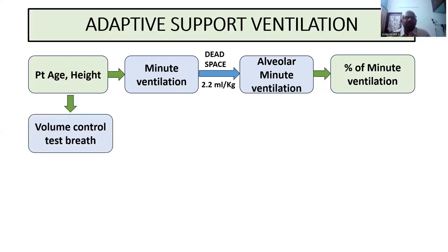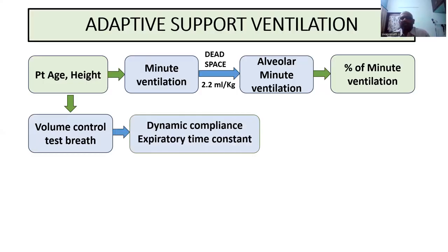Now, once you enter this, it will give a volume control test breath. And once it gives that, it is going to calculate the dynamic compliance and the expiratory time constant. It's a little bit different from all other modes. It will calculate the compliance and the time constant.